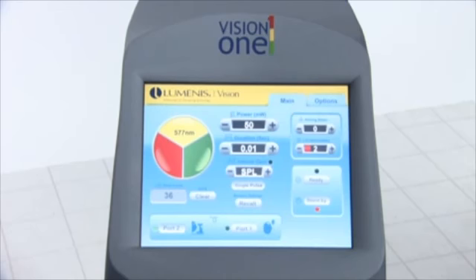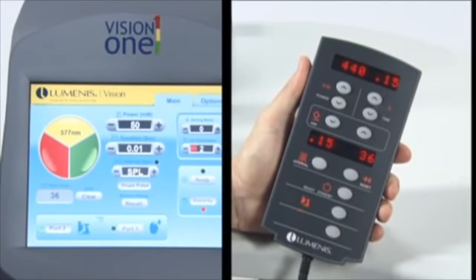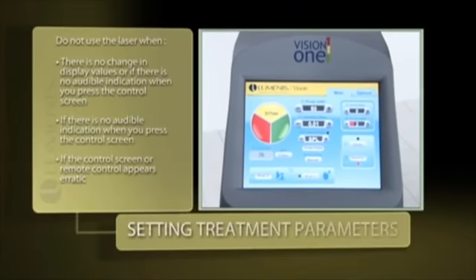You can set treatment parameters from either the laser control screen or the remote control. Always verify that the desired treatment parameters are displayed on the control screen or remote control before initiating treatment. If there is no change in the display values, or if there is no audible indication when you press the control screen or remote control selectors, or if the control screen or remote control appears otherwise erratic, do not use the laser. Contact your local Lumenis representative.